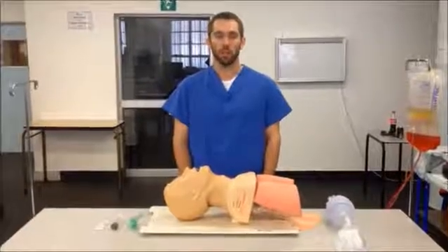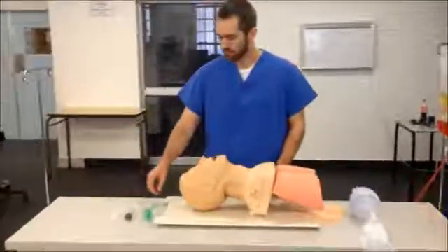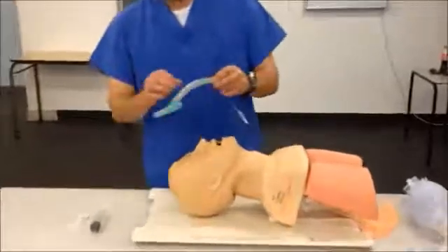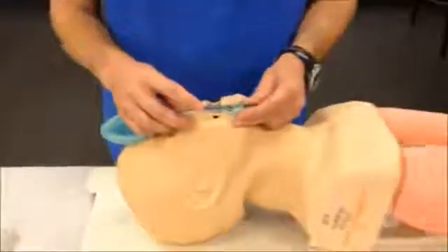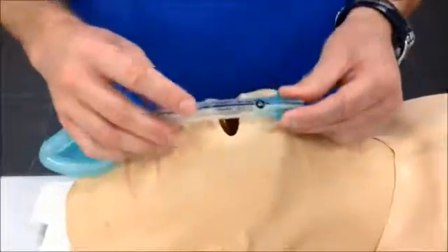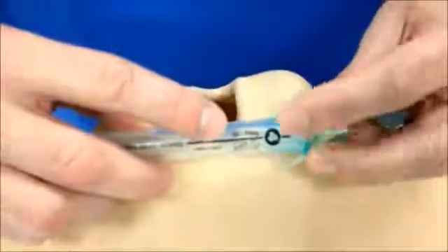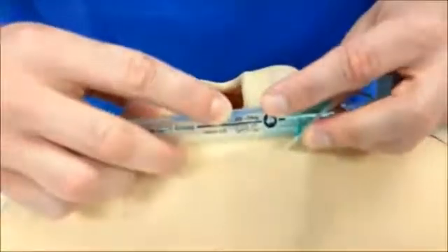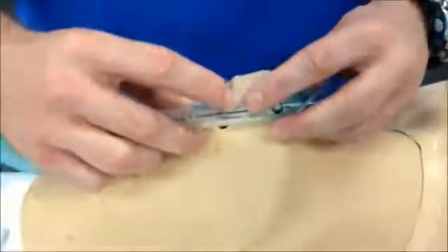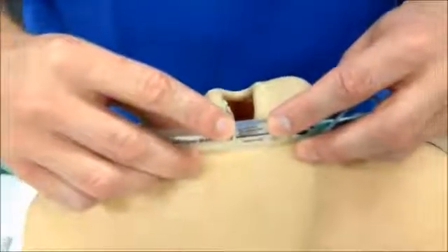The first step in using an LMA correctly is to select the correct size. Sizing of laryngeal mask airways are manufacturer specific, and the instructions will usually be printed on the tube itself. In this case, we can see that it would be appropriate for an adult weighing between 50 and 70 kilograms, and that the amount of air needed to inflate the LMA cuff is 30 milliliters of air.